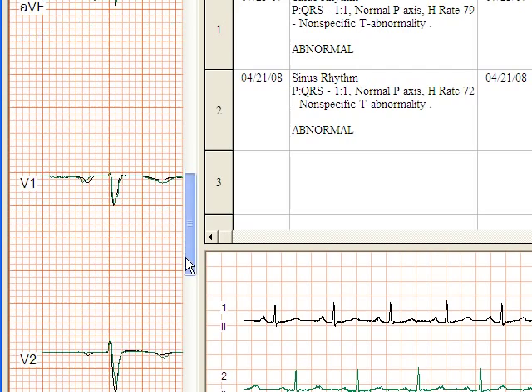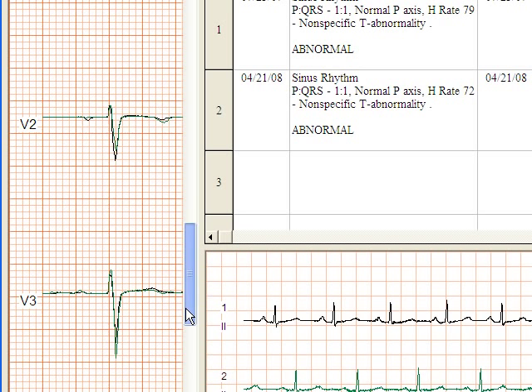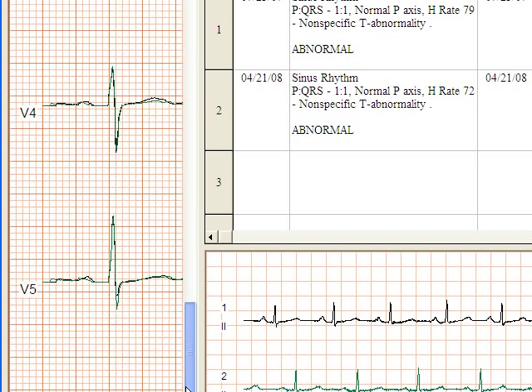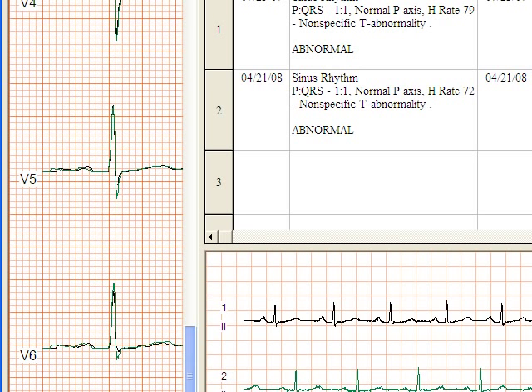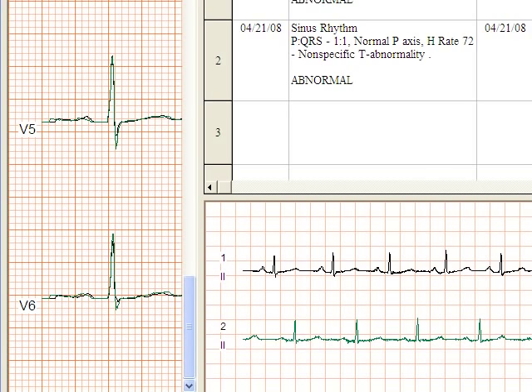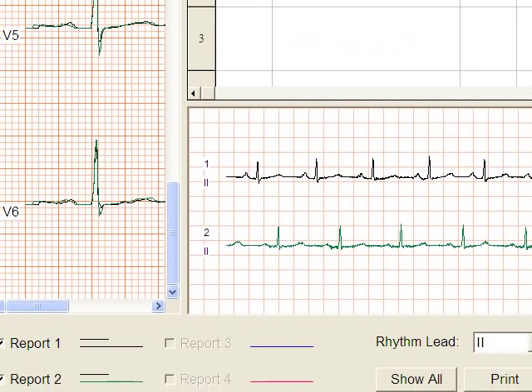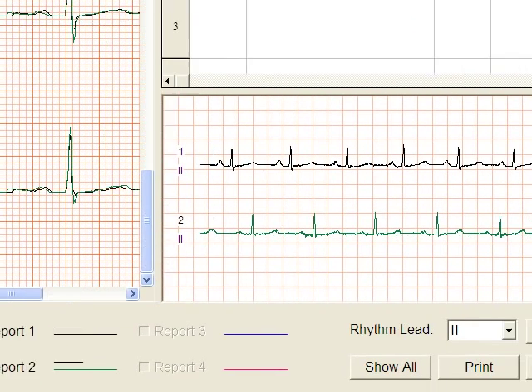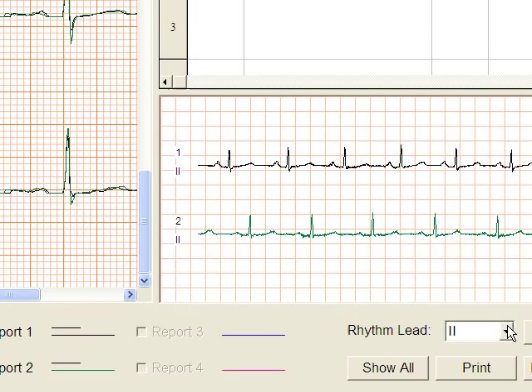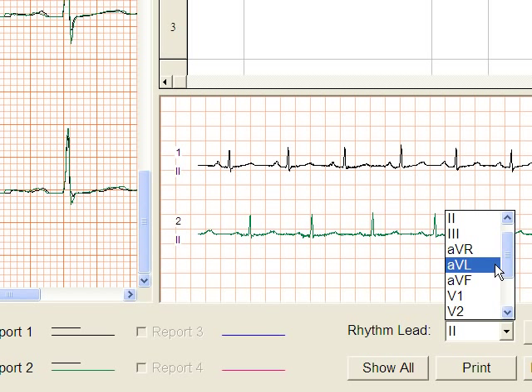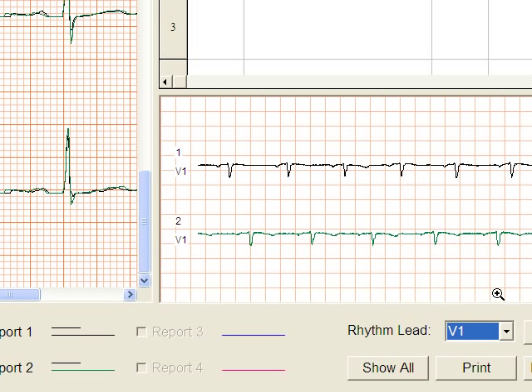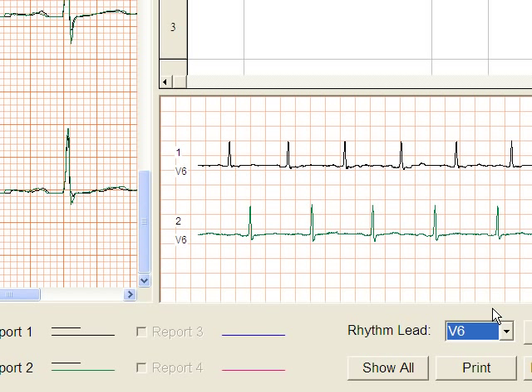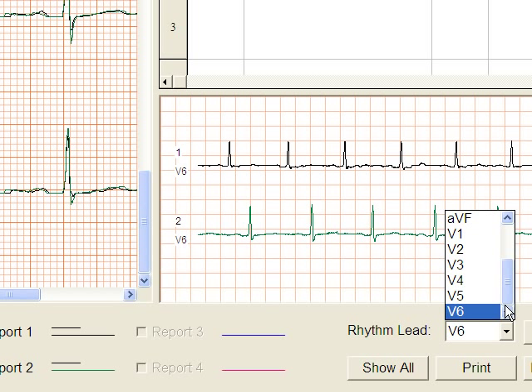There's also a comparison of the interpretations from last year to this year in the middle upper box and then there are the rhythm strips. You can look at different rhythm leads. Let's go ahead and try changing them. You can choose any of the 12 leads as the rhythm lead and compare the rhythm from last year to this year. You can compare up to, I believe, four EKGs simultaneously using this system.